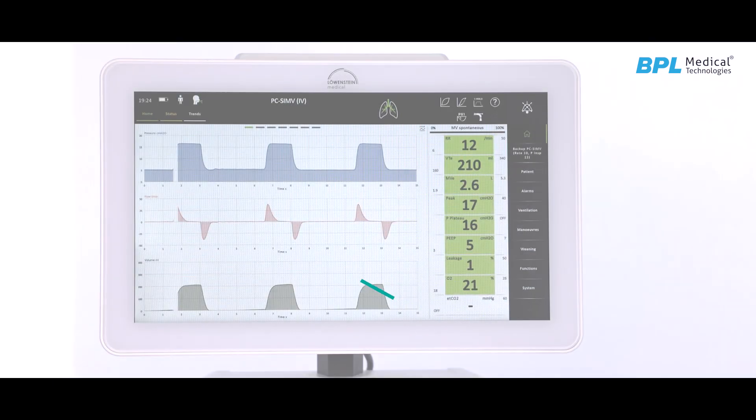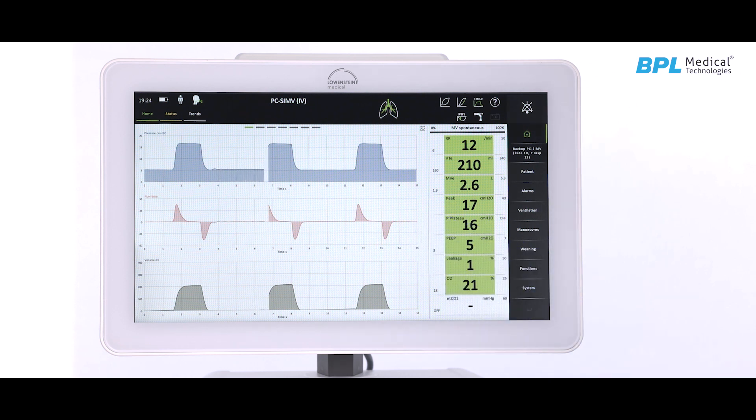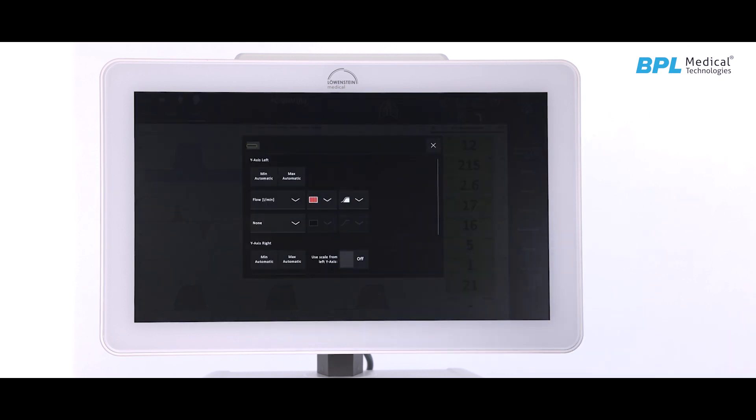ELISA 600 can display up to four waveforms simultaneously in different colors. Waveforms are user configurable by long press on the screen.